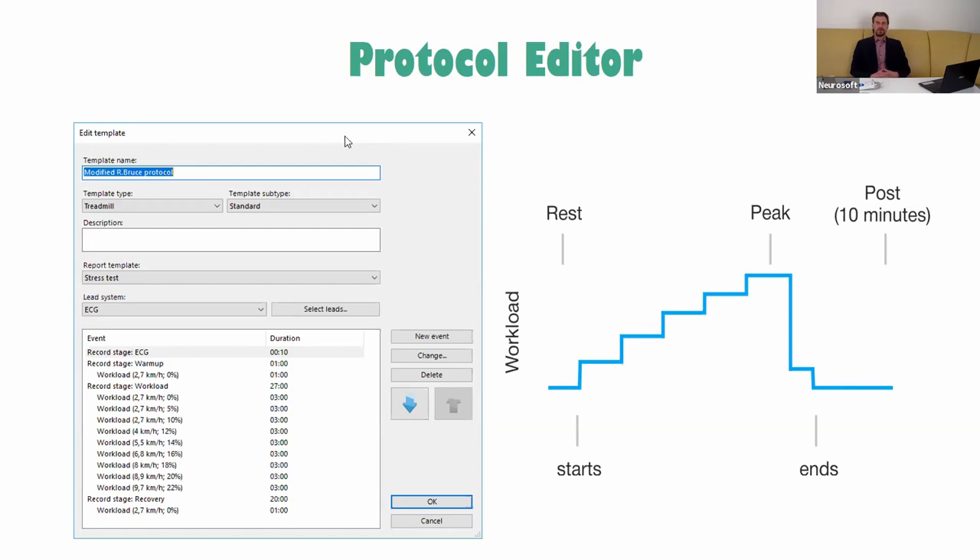If you need to change something in an exercise protocol, or if you need to add your own protocol, you can use our built-in protocol editor — it's a very useful editor, as you can see on this slide.